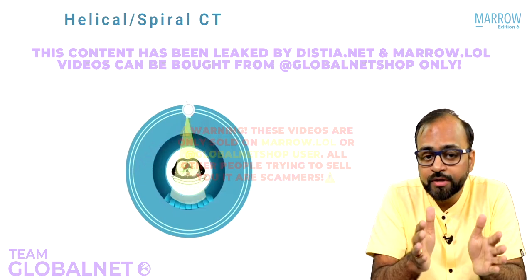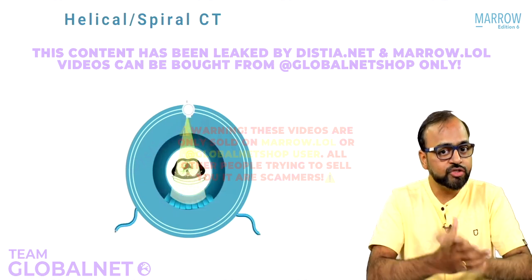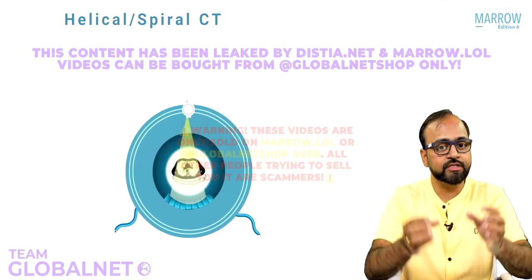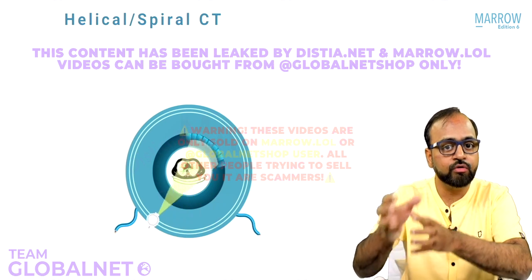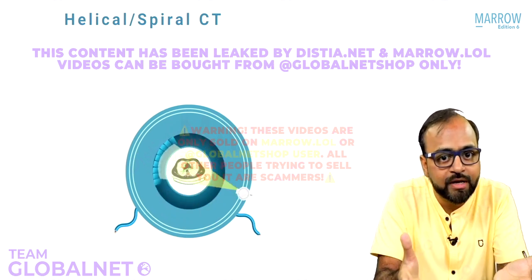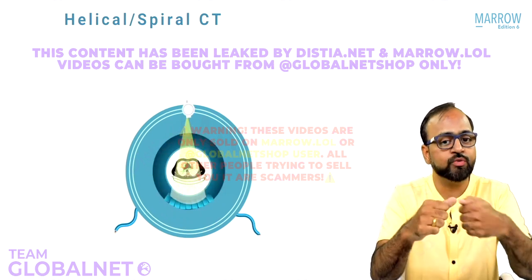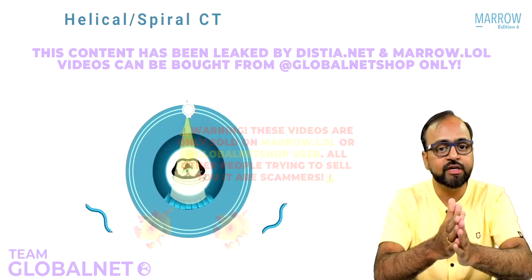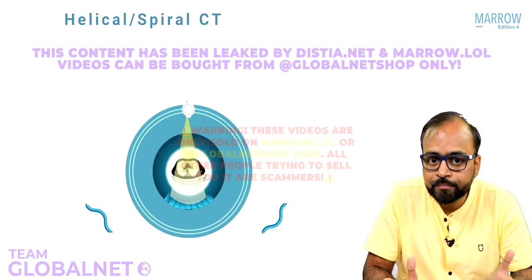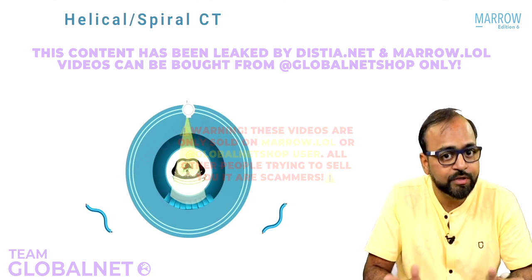But the X-ray tube has very high voltage cables attached to it. What will happen if an X-ray tube to which high voltage cables are attached rotates round and round beyond a few rotations? What will happen to these wires? These high voltage wires will get entangled, they will be pulled out, there will be a short circuit, and the entire machine will explode. We don't want this to happen.